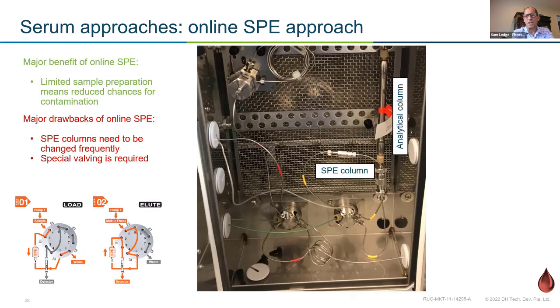And you also have to clean off this cartridge relatively frequently because it's going to get junked up with some of these interferences and extraneous compounds, which you're planning on extracting out anyway. There's also a 96 well plate version similar to the extraction, which is not shown, which offers similar benefits to this online in that it's much more productive. But obviously there's certain benefits to doing it online in that you don't have these additional manual steps.